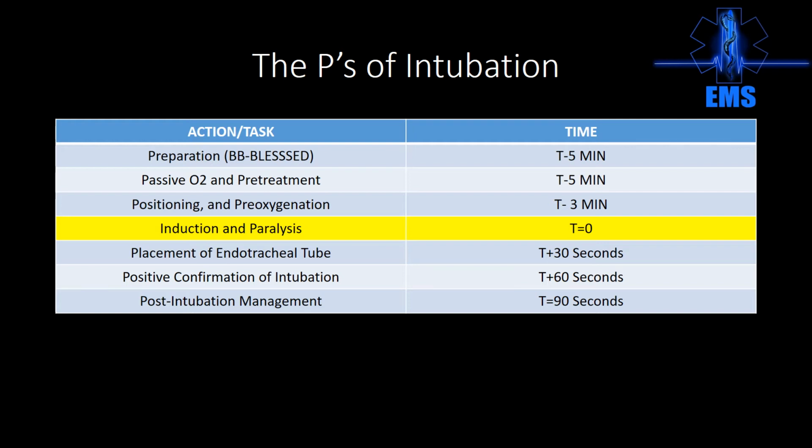In about 3 minutes, you want to start positioning the patient and really focusing on your pre-oxygenation. And this is the time where you're allowed to ventilate the patient. Now, an adult ambu bag, an adult BVM, is a liter. If I was to blow a liter into you, you could probably tolerate that for about 5 or 6 breaths, and then you'd say, no more, I can't take it, that's too much volume. So we can certainly induce barotrauma, but more importantly, remember that McDonald's that was sitting in the stomach? If you blow a liter to somebody, that McDonald's will come up.